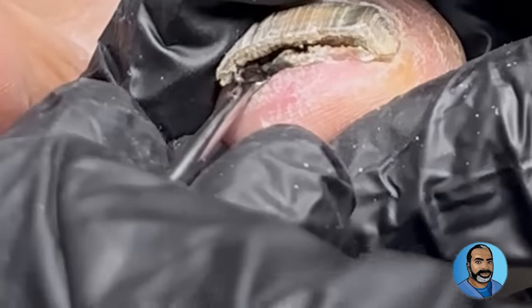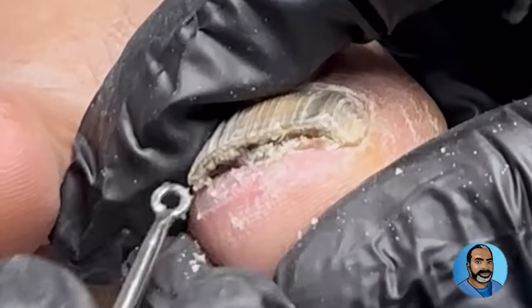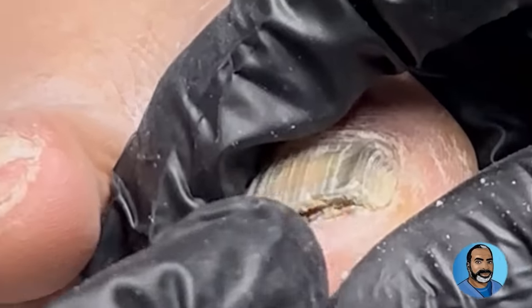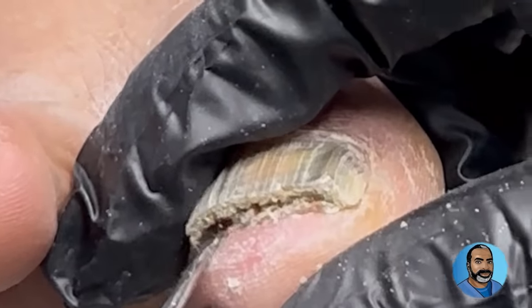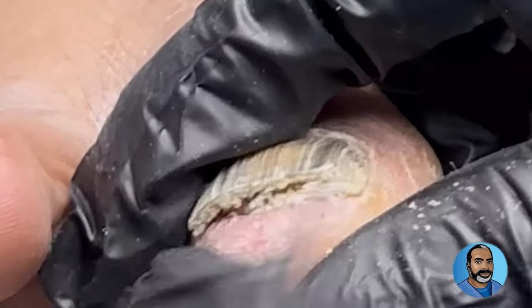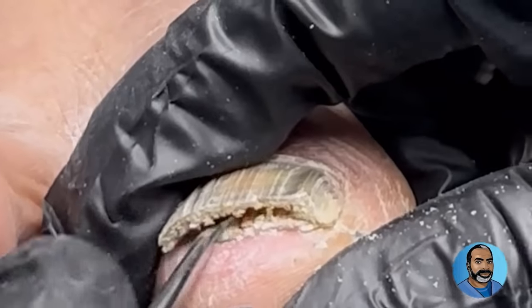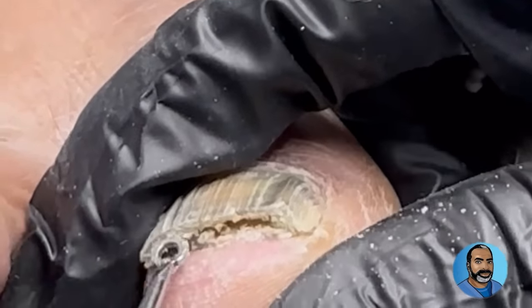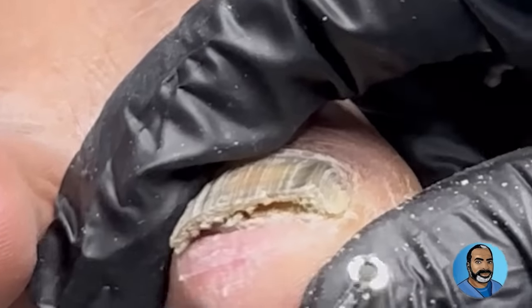Here you can see I'm trying to remove the subungual debris with a blunt curette. The nail is very loose — that's called onycholysis. As the nail plate becomes more and more detached from the underlying nail bed, fluid from bathing and sweating gets trapped underneath the nail. Therefore the fungus is able to continue to grow and thrive. This can continue for years, as it did in this patient.